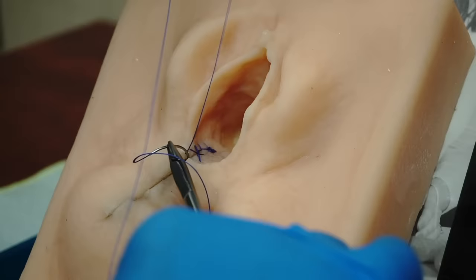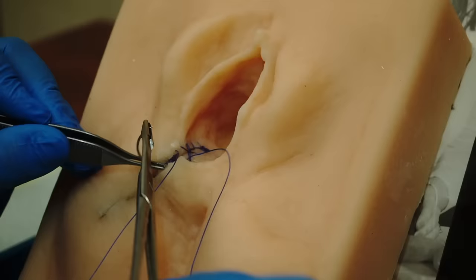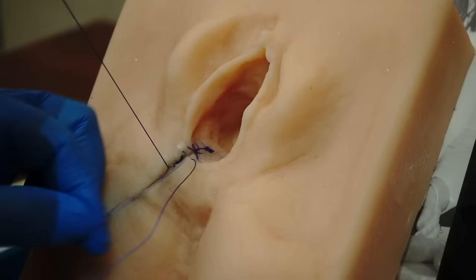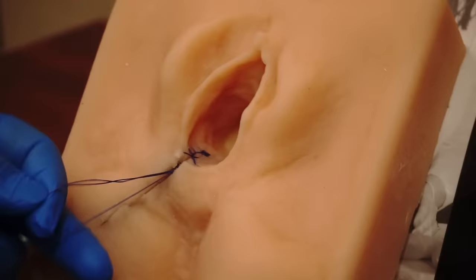I'm going to take a deep bite inside the tissue here going from one side to the other, and as I come through I will be using this very last loop to tie the knot and the subcuticular is complete. The knot has been buried inside the wound — and there you go.